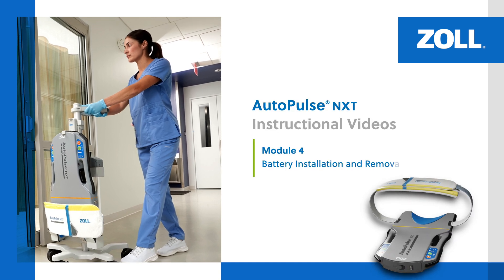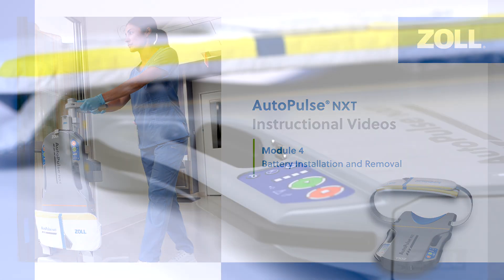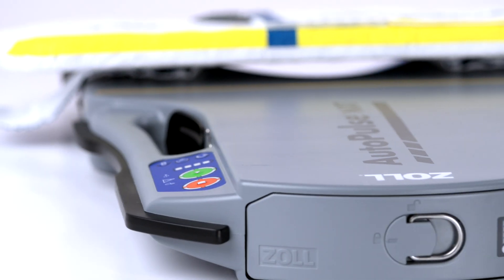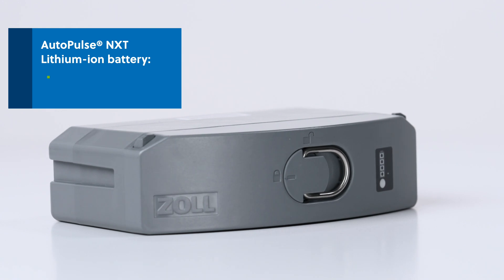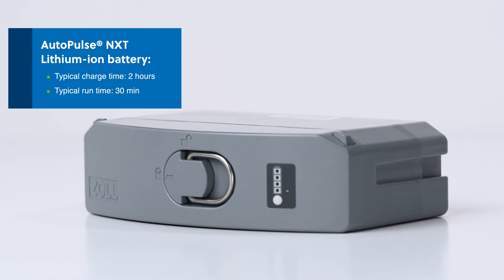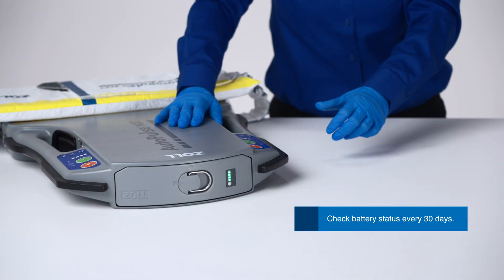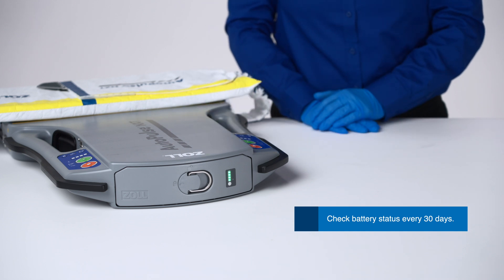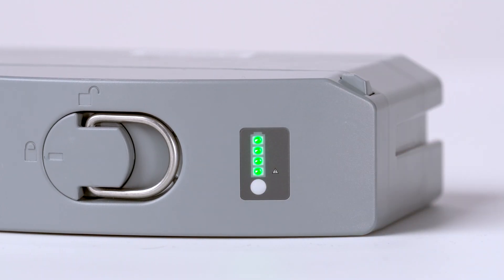In this module, we review how to install and remove the battery. The AutoPulse NXT Resuscitation System is powered by a rechargeable lithium-ion battery. The charge time for the battery is typically 2 hours. The runtime of one battery is typically 30 minutes. It's important to check battery status every 30 days and prior to use by pressing the white battery status indicator button. Always rotate batteries when they display fewer than 4 bars.